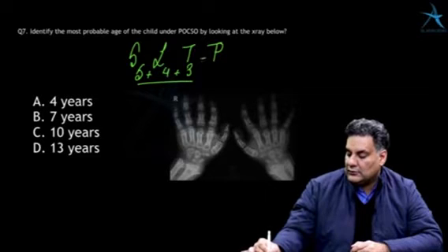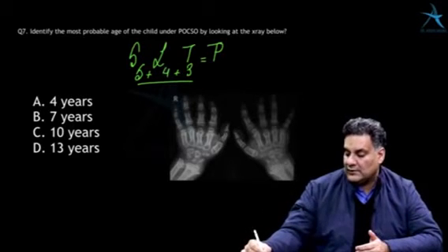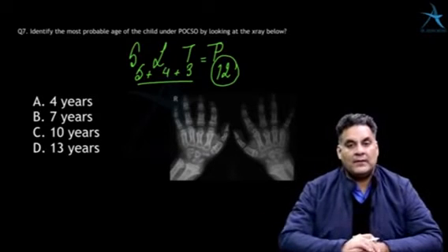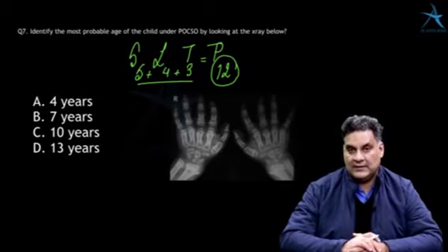So if you total these 3, right? So this is how it goes, like this, pretty. So total of this row is pisiform 12 years. So if you see the pisiform, then the age is going to be 12 years. This is the last carpal bone to ossify.